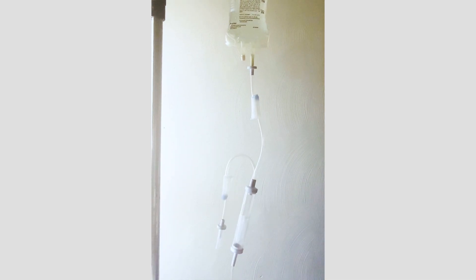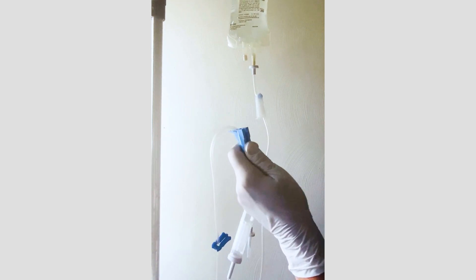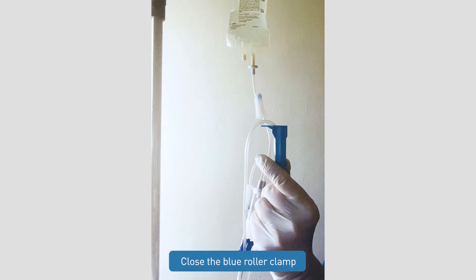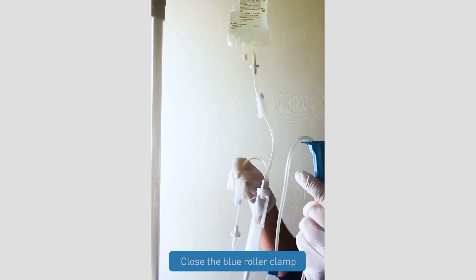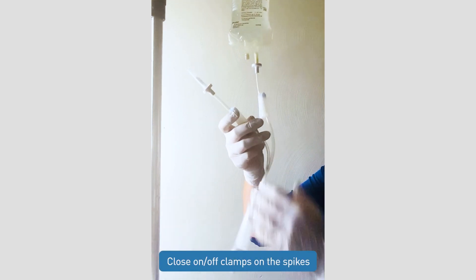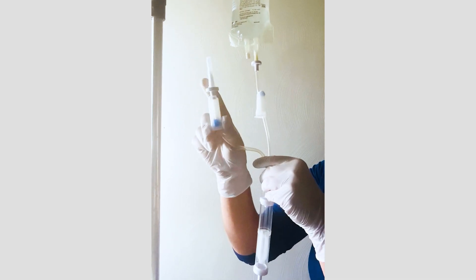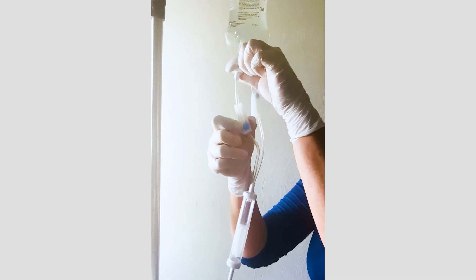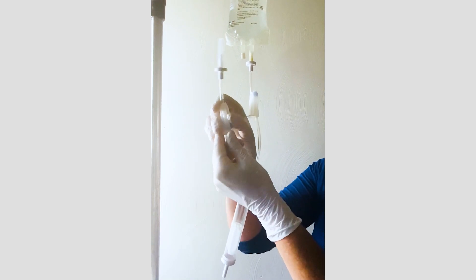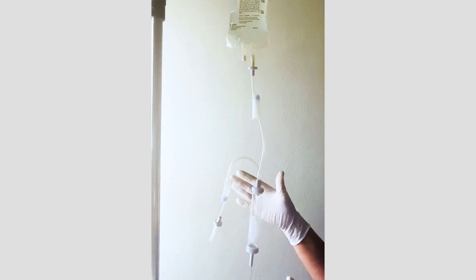When you initially pull the tubing out of the packaging, all of your clamps will be in the open position, so we first need to close our blue roller clamp, and then we'll close our on-off clamps on our spikes. Sometimes when you pull these out of the package, the roller clamp is actually seated on the spike, so we need to just move that down a bit, and then we'll be able to properly close that roller clamp.